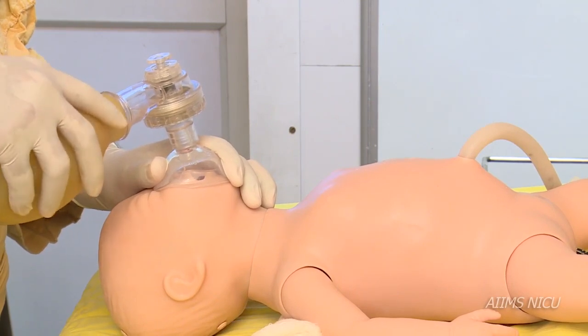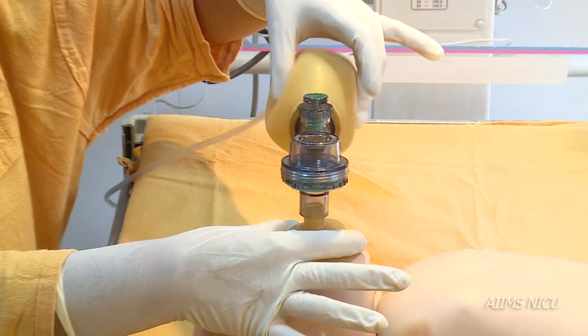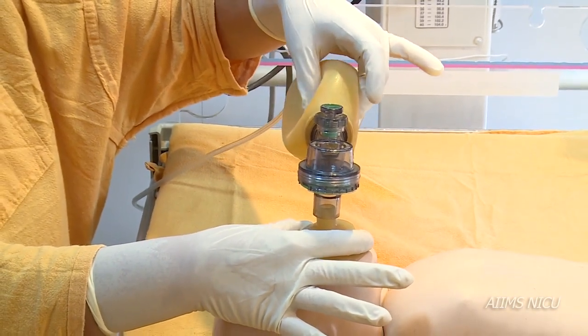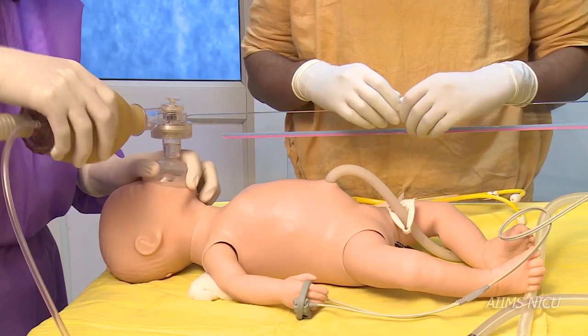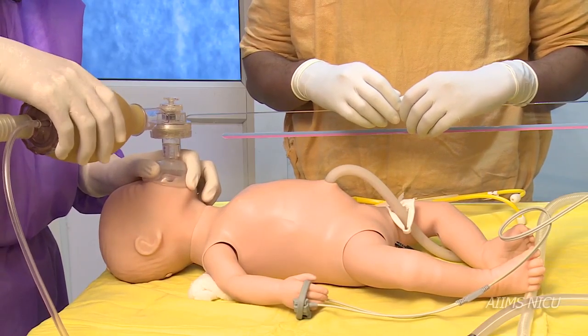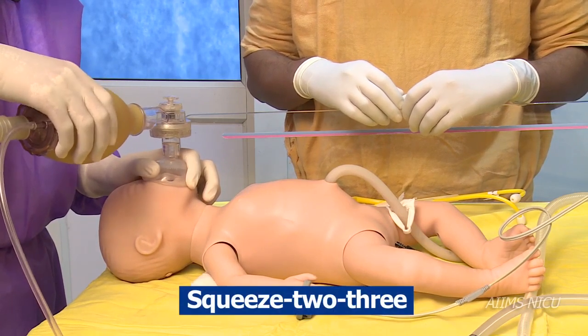Bag and mask ventilation is delivered by squeezing the bag and assessing for effective chest rise. The rate of delivery should be 40 to 60 breaths per minute, achieved by following the sequence: squeeze 2-3, squeeze 2-3, and so on.